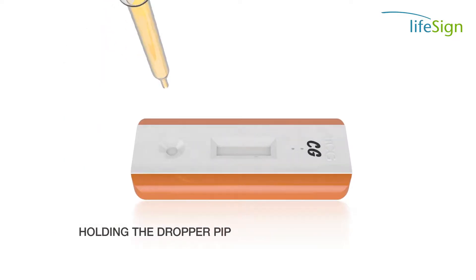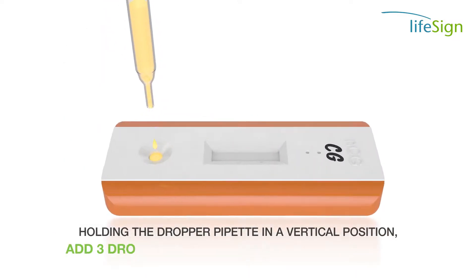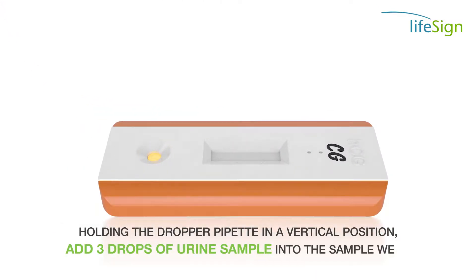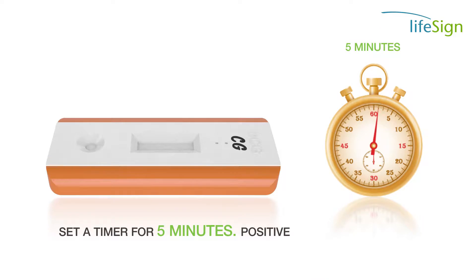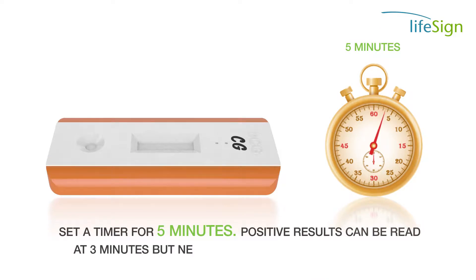Holding the dropper pipette in a vertical position, add three drops of urine sample into the sample well. Discard the pipette and set a timer for 5 minutes. Positive results can be read at 3 minutes, but negative results must be confirmed at 5 minutes.